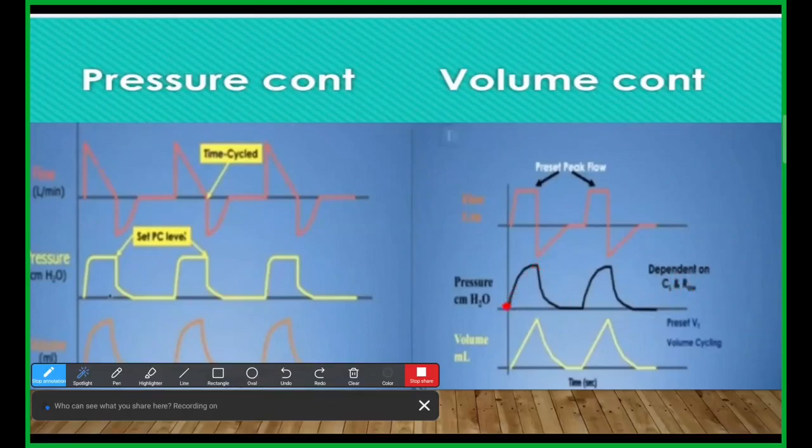So the pressure during inspiration rises and reaches the peak inspiratory pressure at the set tidal volume. When you achieve the tidal volume, the pressure is called the peak inspiratory pressure. After reaching the target tidal volume, your pressure drops and the expiration follows an exponential curve. That is why the pressure time scalar looks like an exponential curve in volume control ventilation.